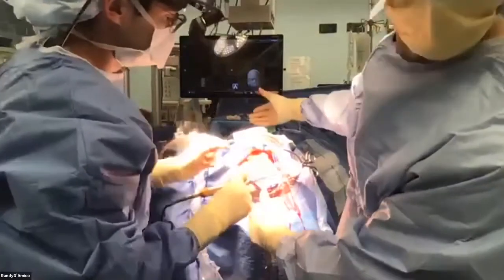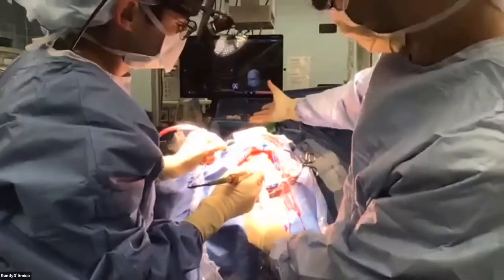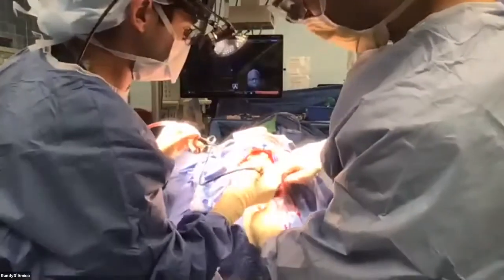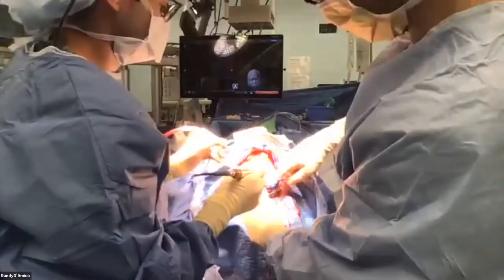It's unmuted, right? So we've got the posterior slot now, and then we're going to take the bone off in a minute. What do you like to do? You strip under here, burr holes out here? What I usually do, I'll show you, but JB's in, so I'll probably scrub out and let him go with you.